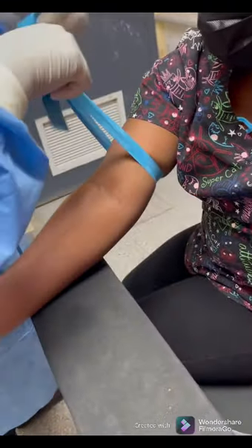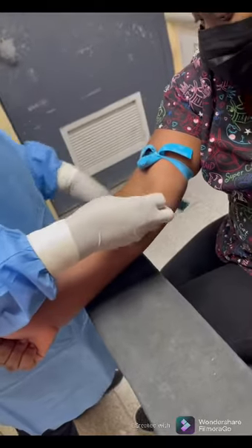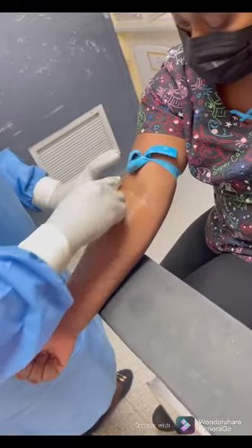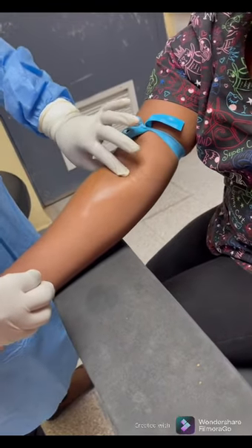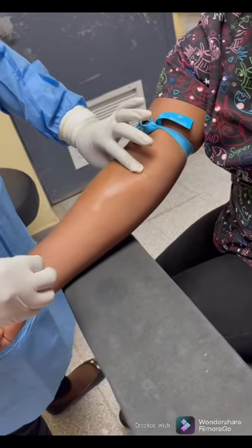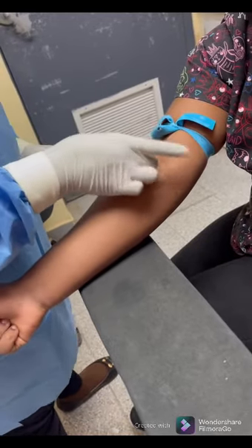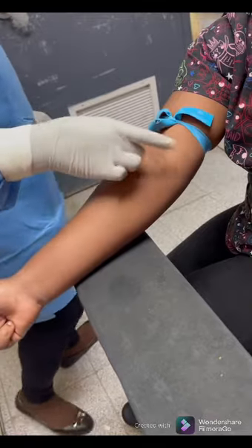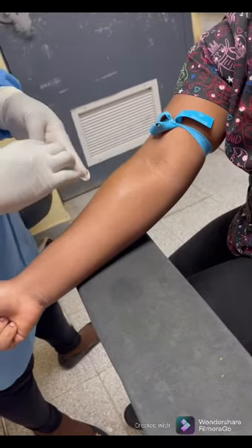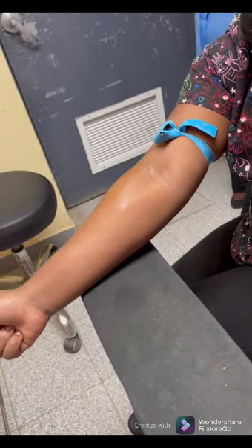Procedure of needle and syringe venipuncture. First, you review an accession test request, approach and identify, and prepare patient. Verify diet restrictions and latex sensitivity. Sanitize hands. Position patient, apply tourniquet, and ask patient to make a fist. Select the vein, release the tourniquet, ask patient to open fist, clean and air dry site.